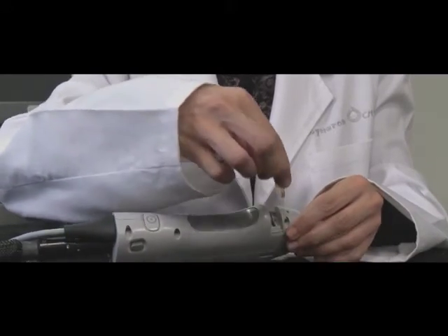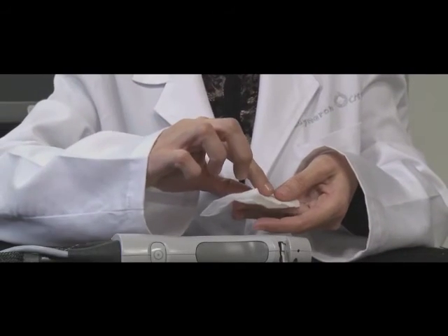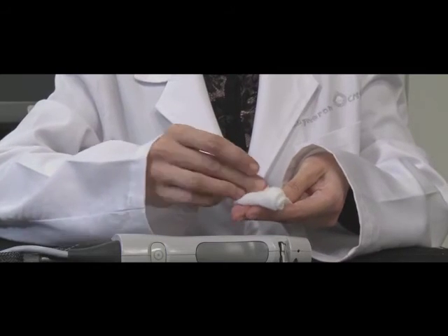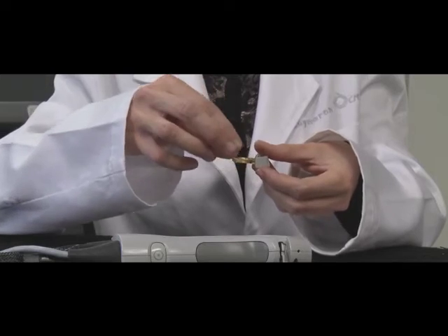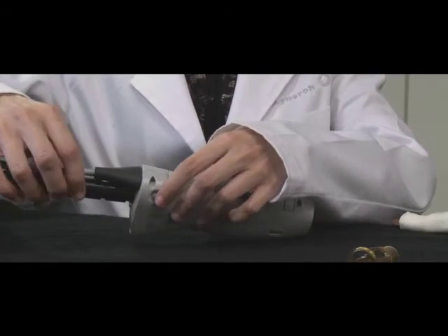The window should be changed approximately every 200 to 300 pulses at the same time as you switch out the distance gauge. In order to change the window, simply slide out the window holder and replace the window. All windows and distance gauges can then be cleaned at the same time at the end of the treatment session.